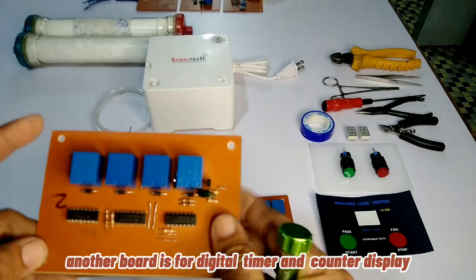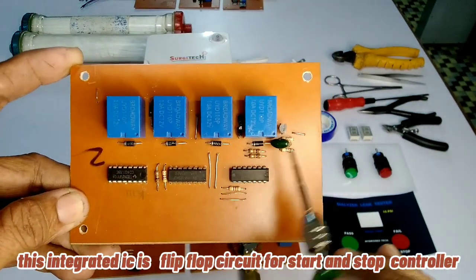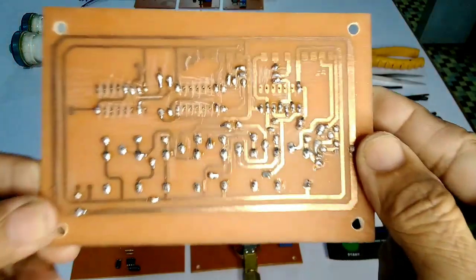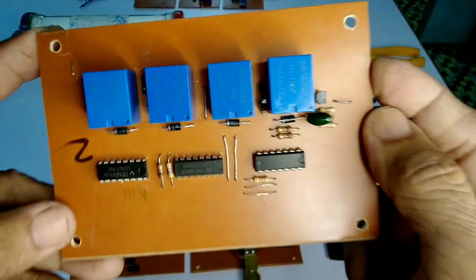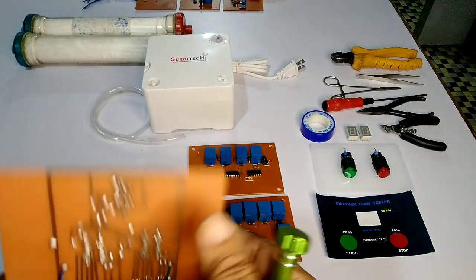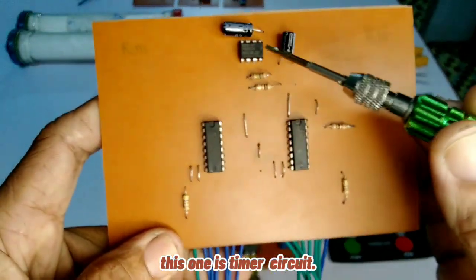Another board is for digital timer and counter display. This integrated circuit is a flip-flop circuit for start and stop control. Next to it is a relay driver and decade counter used in slow range counting. This one is the timer circuit.